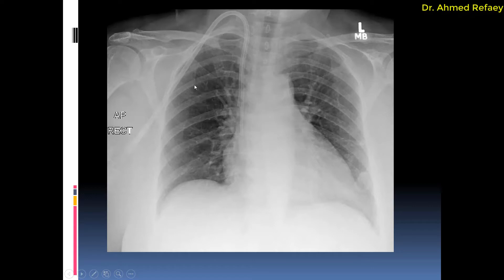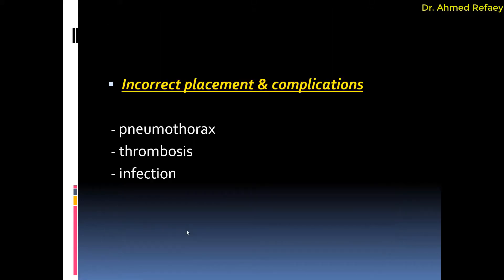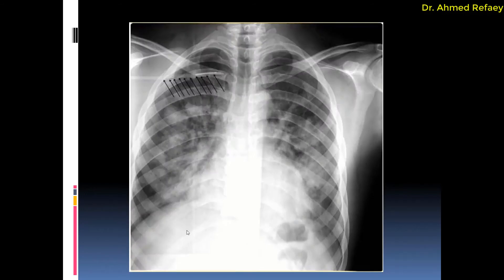This is an example of correct placement of a double lumen hemodialysis catheter or permacath — one tip in the region of the superior vena cava and the other in the right atrium. Regarding incorrect placement and complications: it can cause pneumothorax, thrombosis, and infection. This example shows malpositioning of the hemodialysis catheter, with its tip not reaching the superior vena cava, instead located in the right subclavian vein. That covers everything regarding intravascular catheters. In the next episode we will finish the remaining lines and tubes in the chest. Thank you very much.